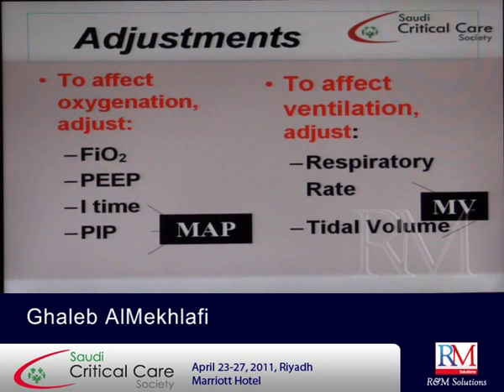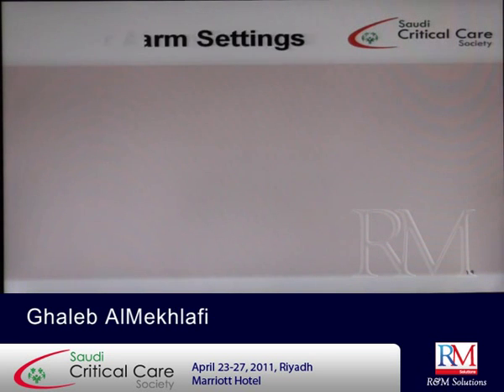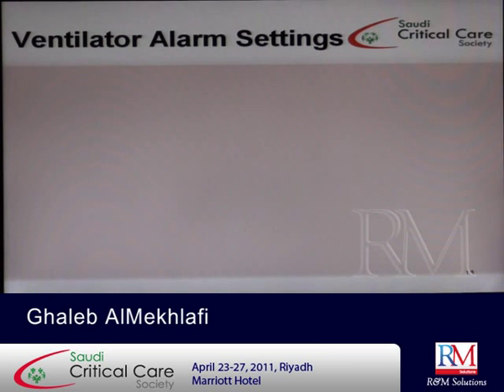Clear? Okay. Now, once you did the setting and you adjusted, you need to keep the patient in a safe situation. And this machine is equipped so that for the parameters you put for the patient, you can make a range for them. If this range is exceeded, whether down or up, then this machine will give you an alarm telling you that there is something wrong. Okay, you did this setting for the patient and they are not in the proper situation. So these machines are equipped with what's called alarms.